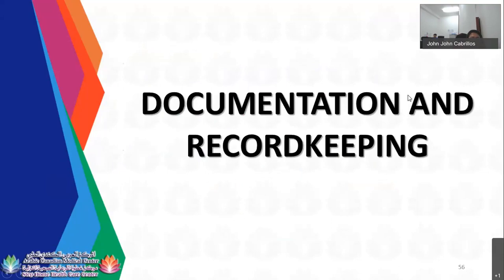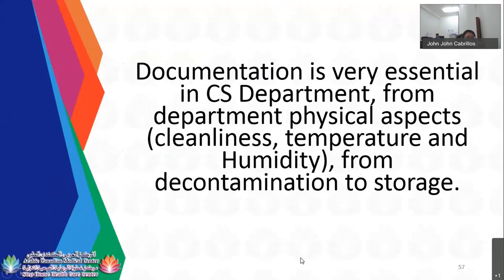So, documentation and record keeping. This is very essential, because in the CS department you need to check whether or not you are compliant with the standard and regulation. Documentation is essential from the department's physical aspects, cleanliness, temperature, humidity, from decontamination to the storage area. Whatever parameters need to be checked, you need to document. Documentation is actually a requirement. It is not an option, but a necessity. It is valid proof or evidence that indicates your department and processes meet the standard protocols set by the health authority. This is also used to improve the flow of your workflow.